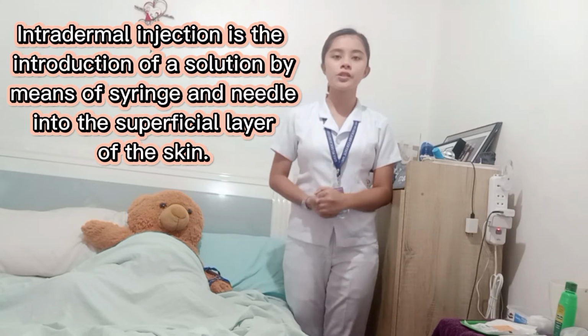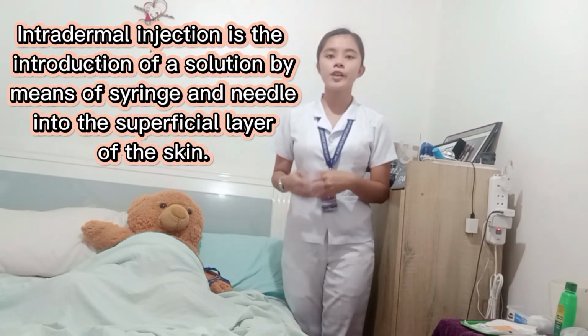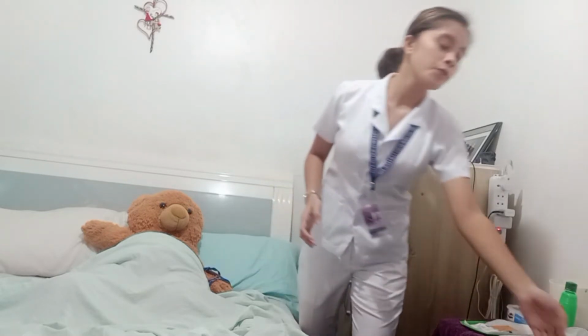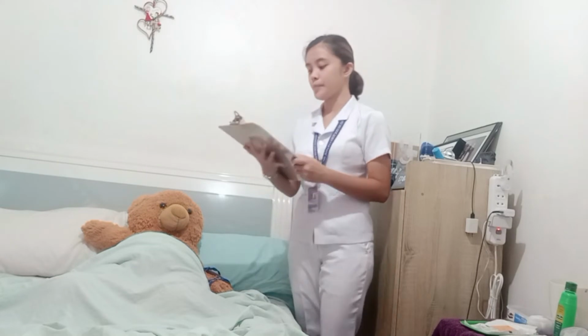So now I am going to perform the intradermal injection. So the intradermal injection is the introduction of a solution by means of syringe and needle into the superficial layer of the skin. So now I am ready to administer the medication. So first thing to do is to check the doctor's order on the patient's chart because it is more reliable than the medication ticket.